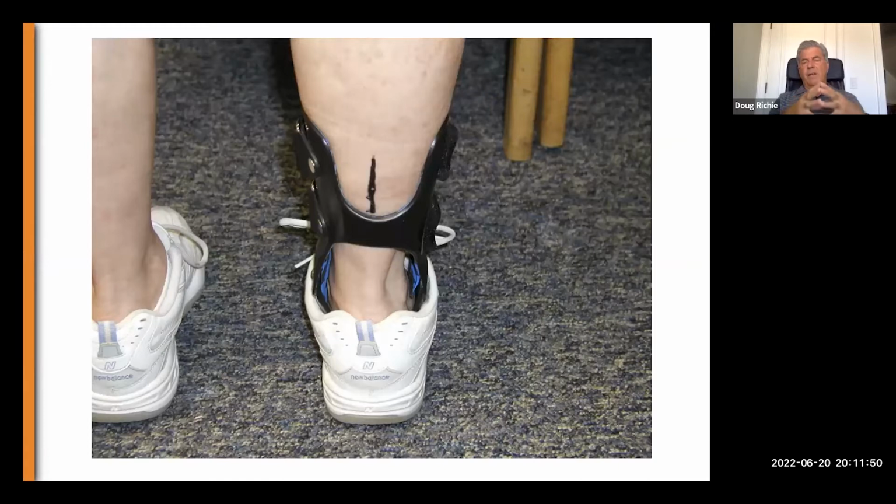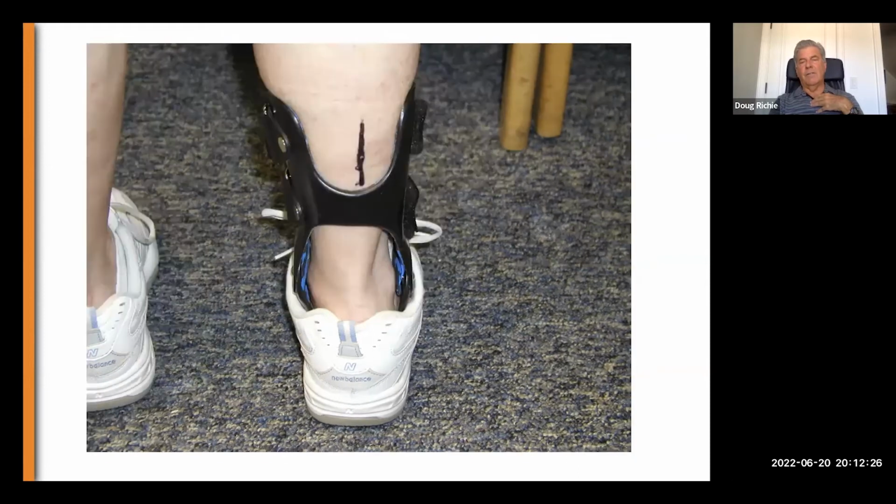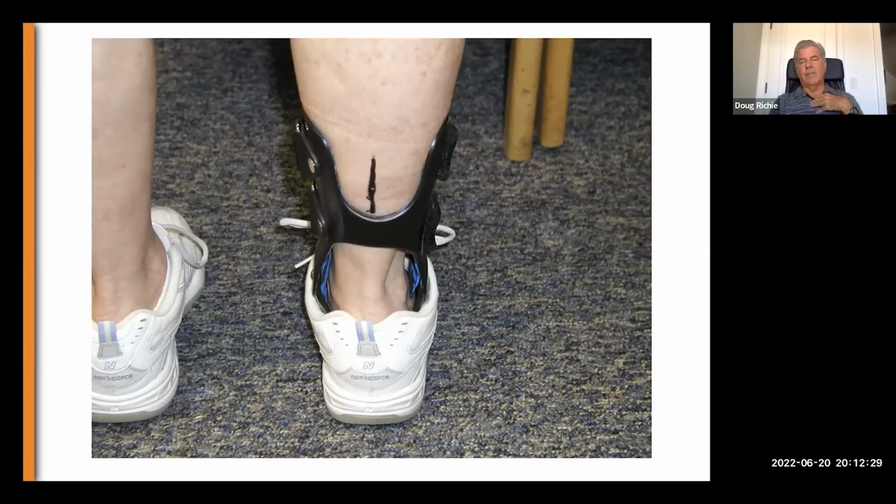This is an example of a knockoff version of a Richie brace. We see these in the United States fairly frequently, where orthotists instinctively think that they need to secure the entire limb upright with a posterior bar of rigid plastic, really making the entire lower limb uprights connected in one solid unit. The problem here is you can't cinch it to the leg. Once this bar is placed across, you cannot tighten it any further. And this patient came in my office, and as you can see, she has significant internal and external rotation inside of the brace of her tibia.